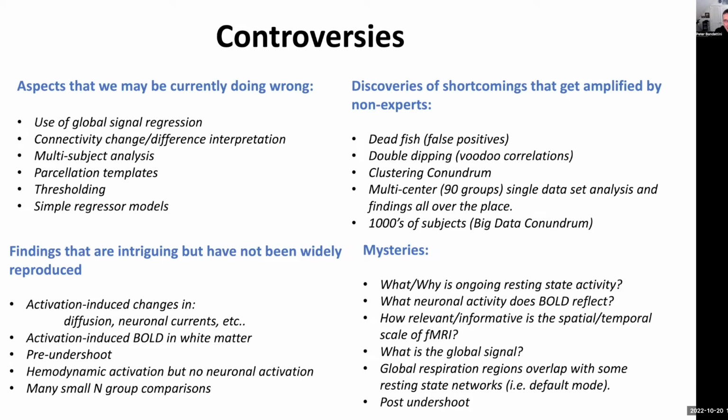They got different findings, a lot of different findings. And I believe that was somewhat of a straw man, because a lot of them used stringent thresholds, and then they compared the spatial alignment after they used thresholding. And of course they were different, but there's a lot of real activity below threshold that we still haven't figured out how to set that threshold. There's no one statistical test that tells you how to threshold.